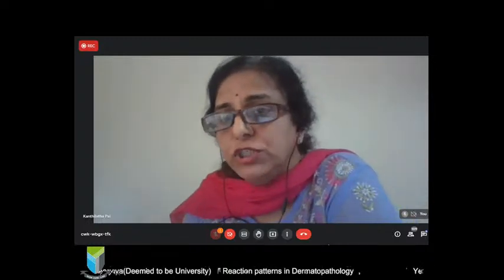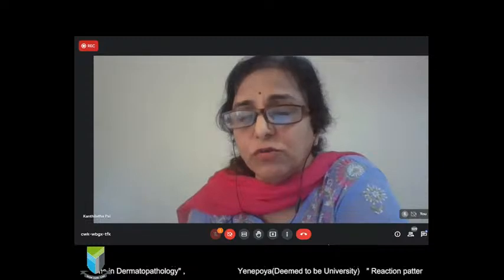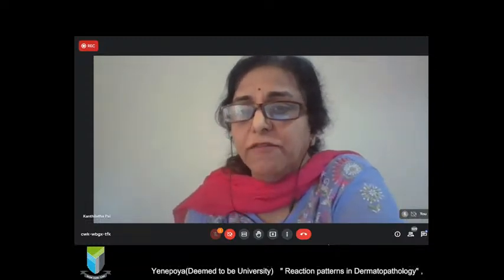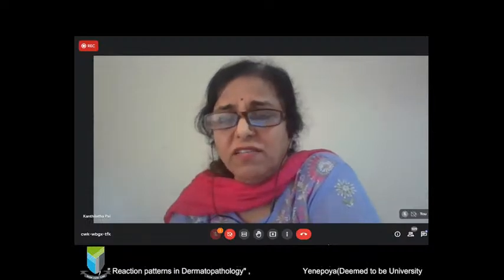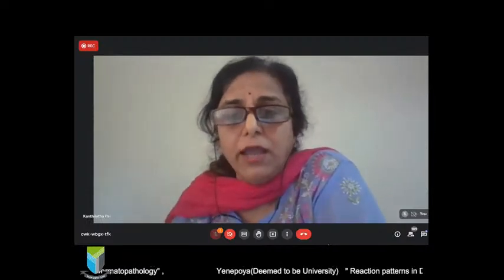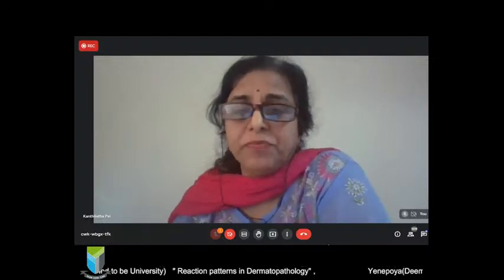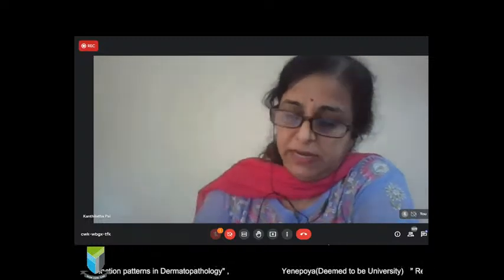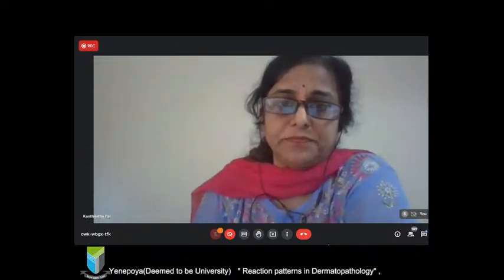Or if you see a spongiotic dermatitis with a lot of neutrophils, normally you don't see neutrophils, it's usually eosinophils that are seen. But if you see a lot of neutrophils, it suggests an irritant contact dermatitis. So these are some pointers which may give a clue to the cause of dermatitis, but not always. But if these are there, you may make a mention of that in your comment.